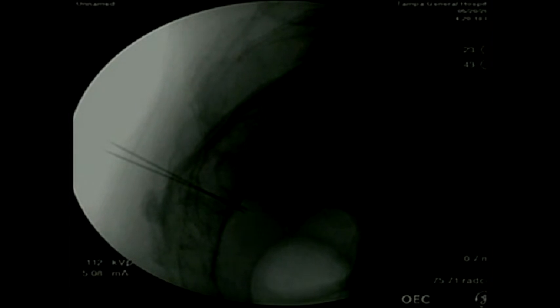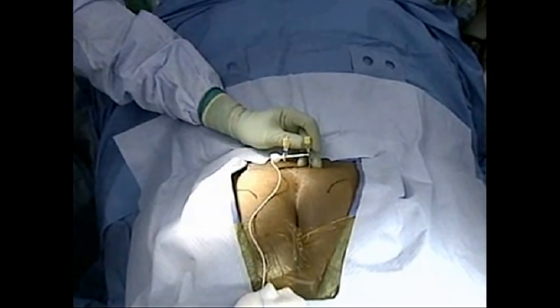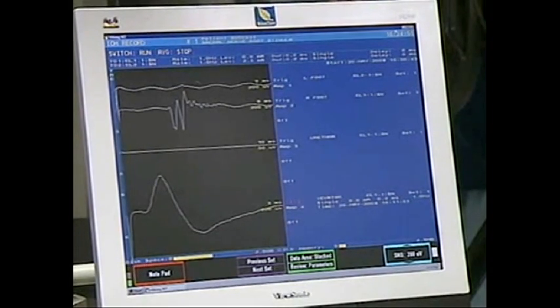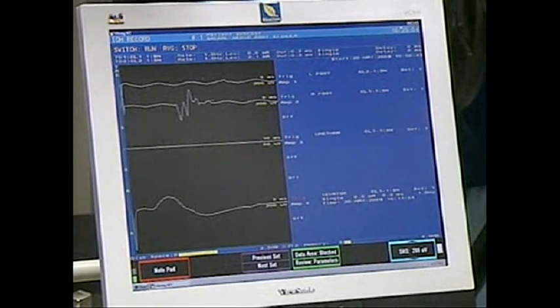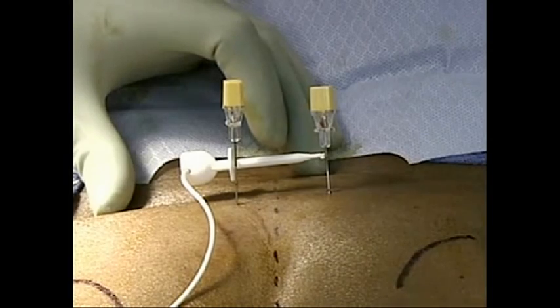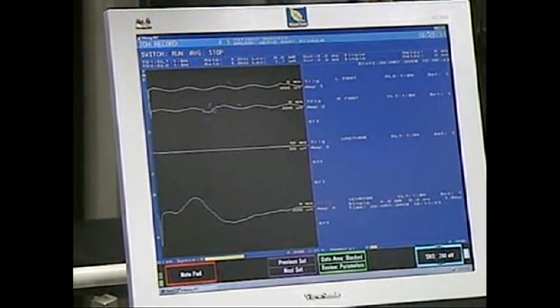I'm going to move the needle a little bit and apply the stimulus once again — going to around two, two and a half. I went ahead and introduced it a little bit more and I'm starting to get an actual response. So I'm starting to pick up the nerve. The depth of the needle is a little bit further than what I like to see. So if I had to choose between my left or my right, based on this, I'm going to go with the left. This illustrates one of the benefits of the compound muscle action potential — it's very sensitive in terms of movement of the needle and gives me a very good physiologic picture of what's going on.